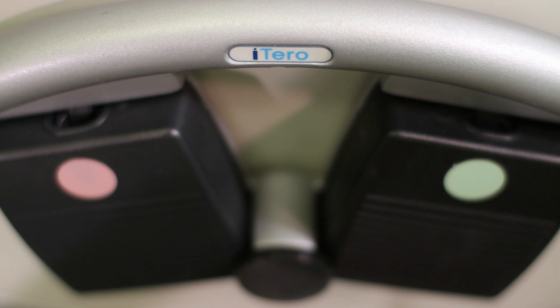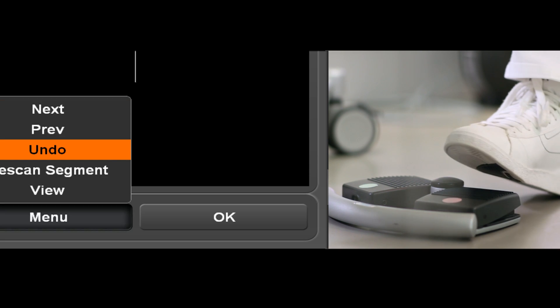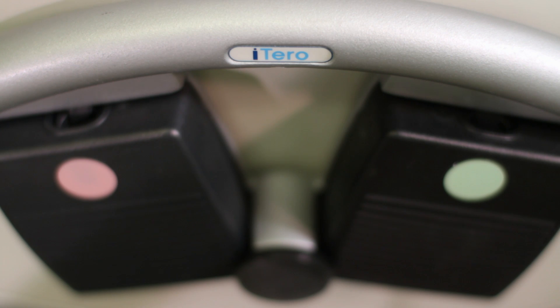One of the most convenient features of iTero is the dual pedal control. It can be placed wherever it is most comfortable for the user. The pink pedal is used to access the menu selection during scanning. The green pedal is used to select menu items, such as moving from one segment to another.